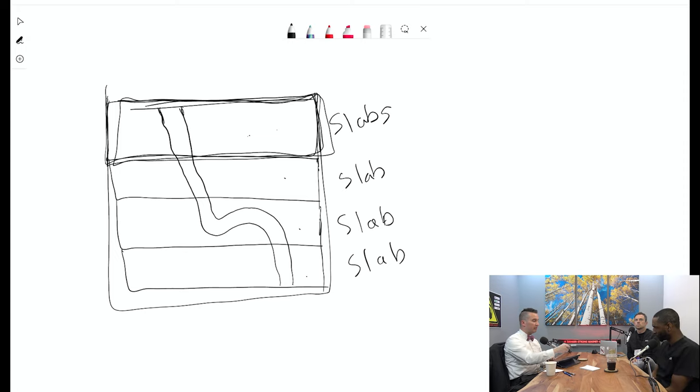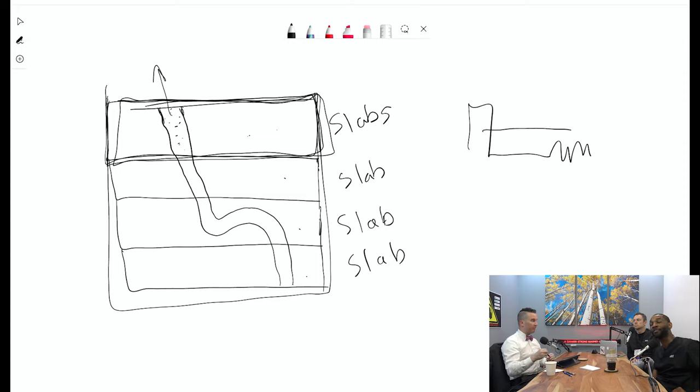Yeah. So we're doing a slab selective excitation pulse, which is really good, because we've got all these yummy protons moving this way. The idea is we want a really, really short TE. Typically inside of these gradient echo 3D sequences, we want a short TR and a short TE. The longer the TE, the greater chance you're giving the blood to leave, because there's time between the excitation pulse and the readout. And that's the time of flight.